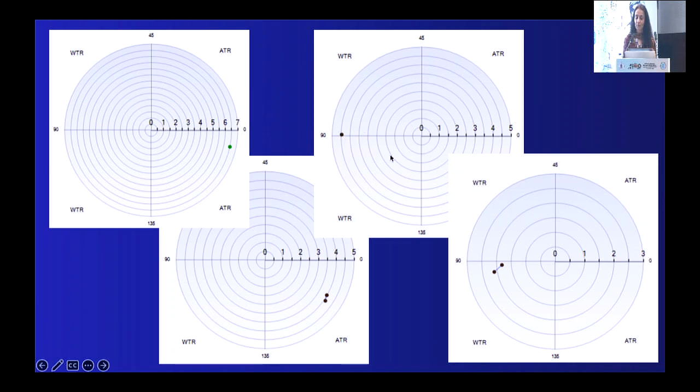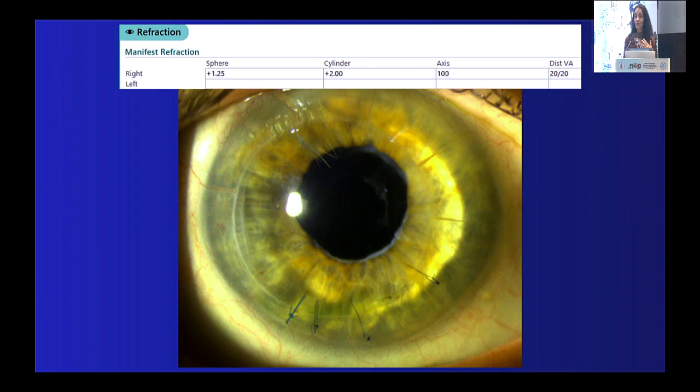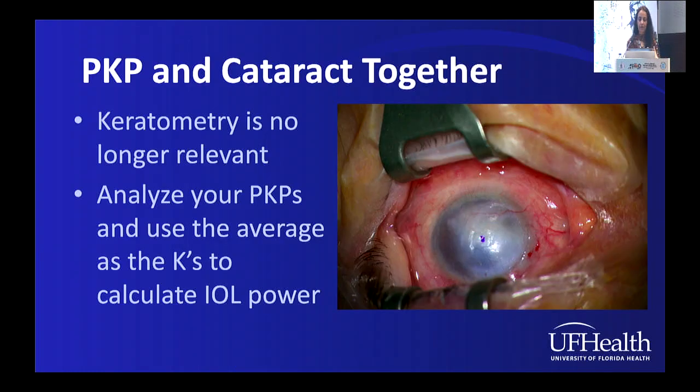So I took a couple of sutures out, and they were then down to 1.5 to 2 diopters of astigmatism with the rule, which I thought was a pretty good outcome. She was thrilled. The other eye had RK2 and was hyperopic. She was matched up. She was 20/20 with a small prescription for glasses, and very happy with this. Even though it wasn't perfectly regular, she still got a pretty good outcome.